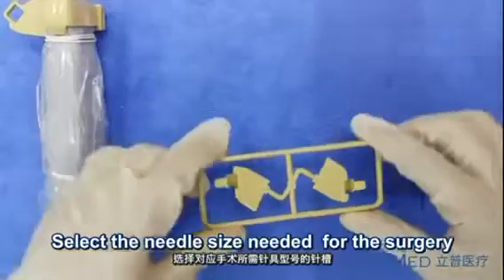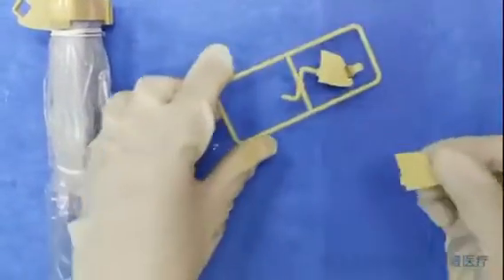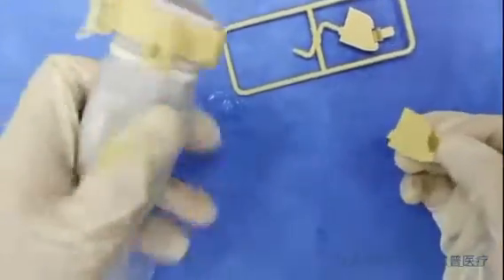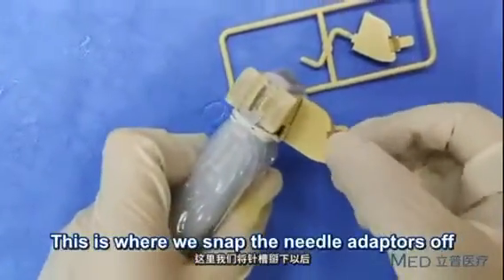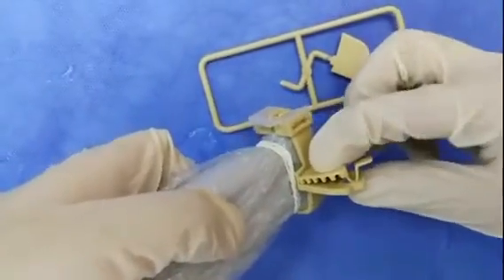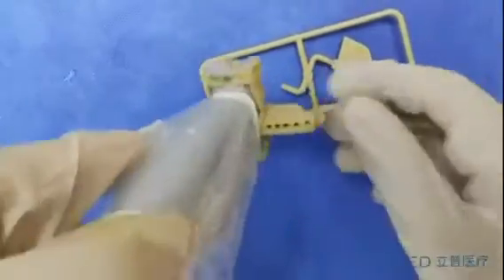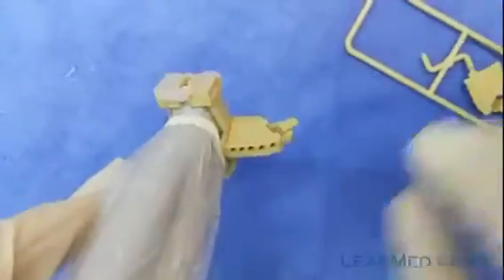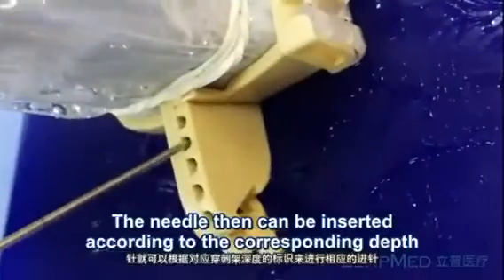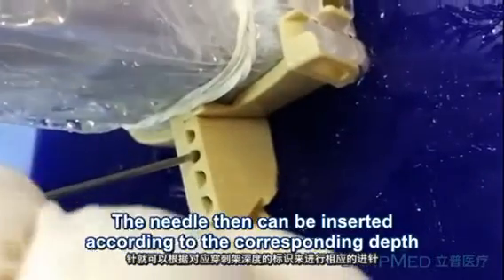Select the needle size needed for the surgery. This is where we snap the needle adapter, assembling them on the right position for the needle guide. The needle can then be inserted according to the corresponding depth.